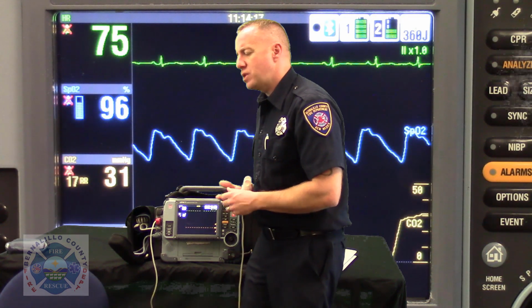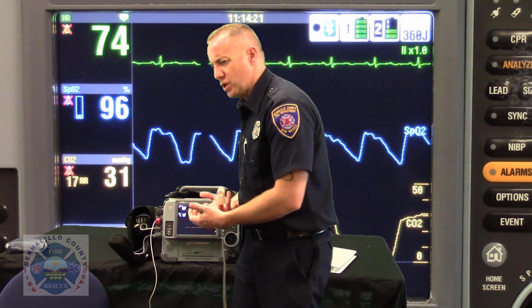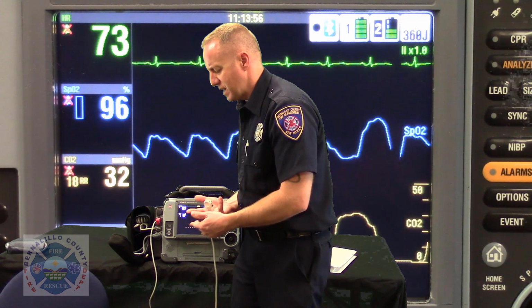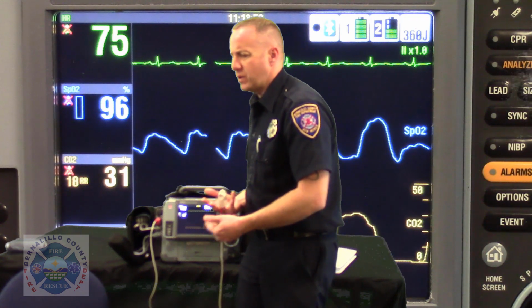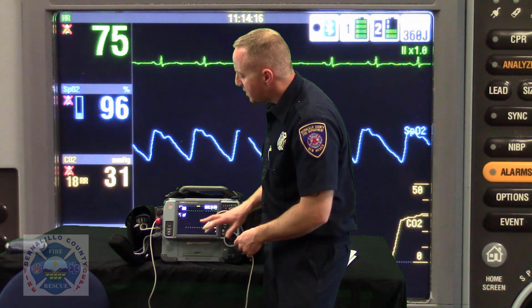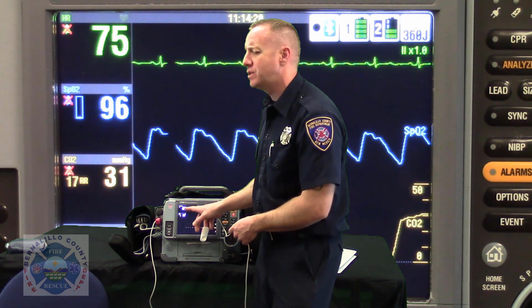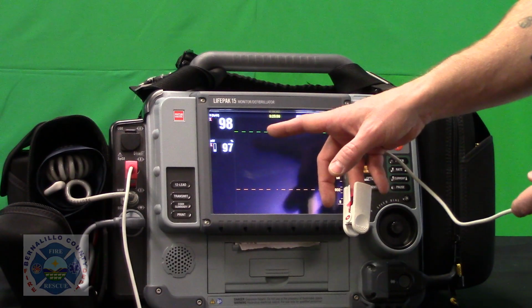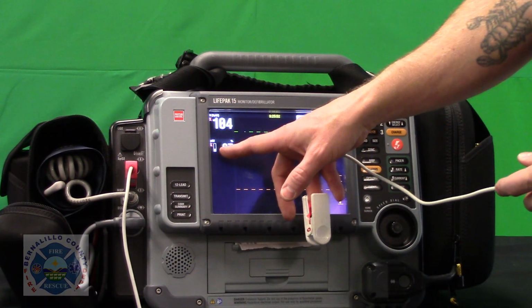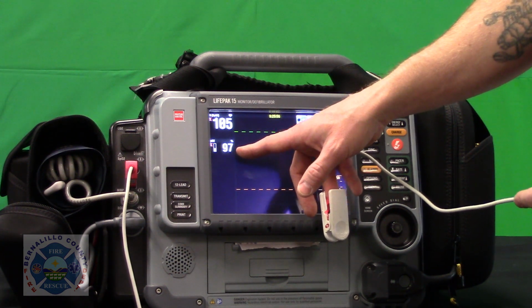And so you want to make sure that you're still touching your patients and you're feeling the temperature and the cap refill of the finger that you decide to use, all indications of whether you're going to get an accurate reading. All right? So, things that you might not have appreciated, and this is on the Lifepack15 screen, and it's also on your ToughStat pulse oximeter, is this bouncing graph off to the side of your digital readout of your pulse oximetry reading.